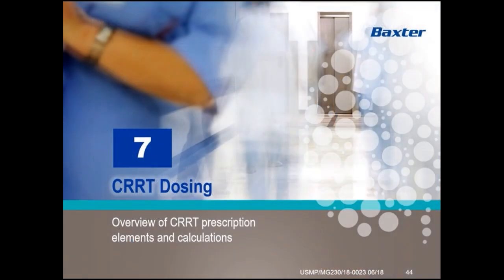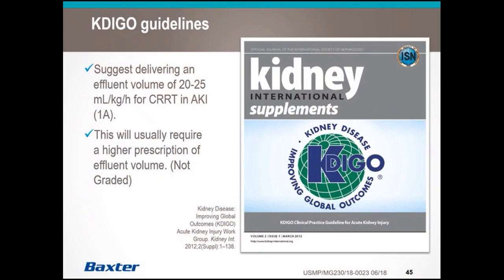Next, we're going to discuss CRRT dosing. Dosing in CRRT is just like dosing in any other medical condition, so it's important to dose your patient appropriately so that you can see the results that you are anticipating or want to achieve with your CRRT patient. The KDIGO guidelines that we discussed earlier give specific recommendations for dosing a CRRT patient.